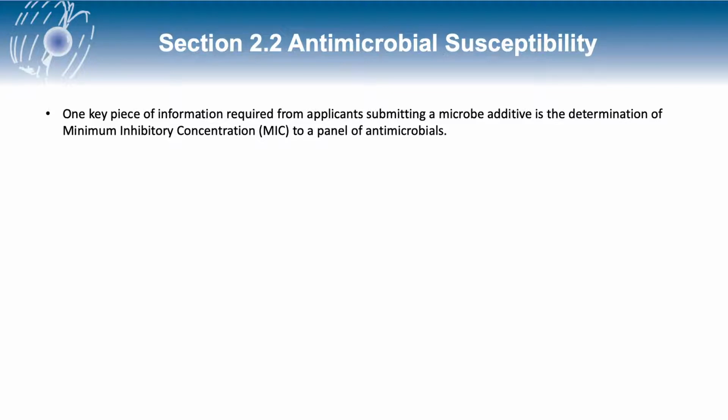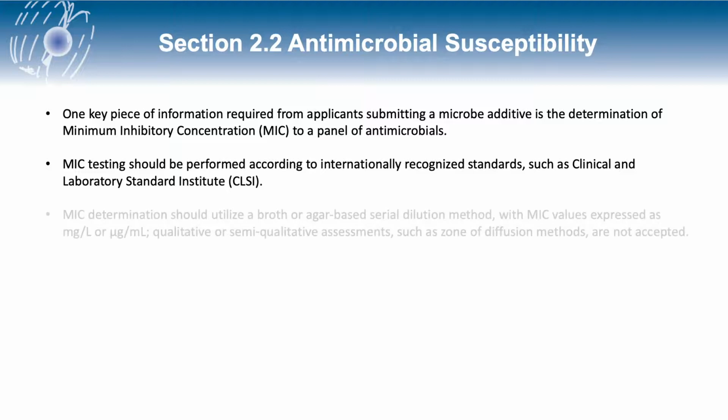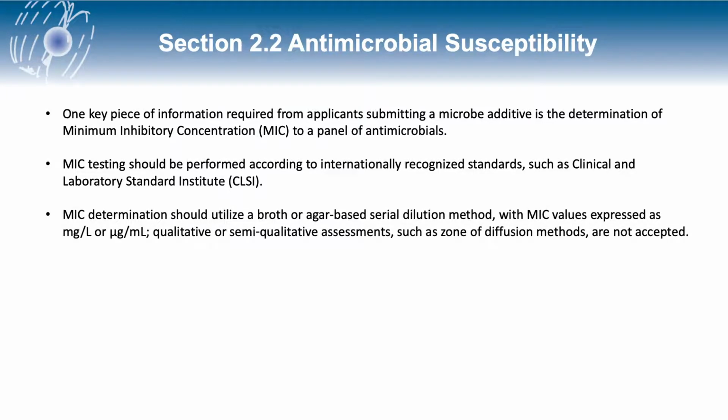With regards to microbes used in feed additives, the applicant is required to determine and submit the MIC of their organism against a panel of antimicrobials. To fulfill the requirements of the EFSA FEEDAP guideline, MIC testing should be performed according to internationally recognized standards, such as Clinical and Laboratory Standards Institute, CLSI. MIC determination should utilize a broth or agar-based serial dilution method with MIC values expressed as milligram per liter or micrograms per milliliter. Qualitative or semi-qualitative assessments, such as zone of diffusion methods, are not accepted.